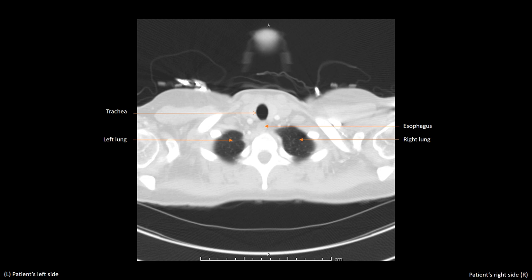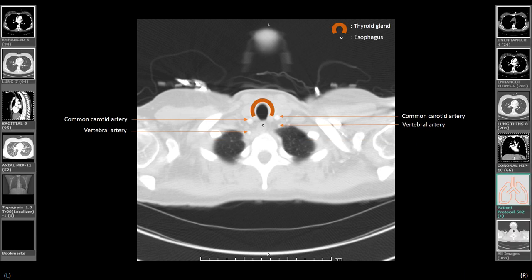The right side of the image corresponds to the right side of the patient. So let's start navigating into the airways. Past the vocal cords, the upper trachea is wrapped by the thyroid gland anteriorly. Laterally, you see the common carotid arteries that may get very close to the trachea at the base of the neck. Posteriorly, the membranous wall of the trachea rests on the esophagus.